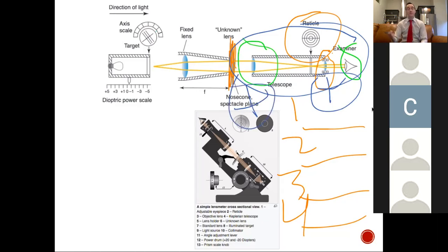And a way you can remember this would be perhaps if you were stargazing and you have a telescope kind of in your hand. That way we can piece this together if they were to draw an arrow at the different areas within the lensometer, okay? In contrast, if we had a Galilean telescope, we would have a minus power for our ocular and a plus for our objective, okay? And so the telescope portion is designed to reduce any type of accommodative effort we may have, and any kind of refractive effort we're putting into the device, right?